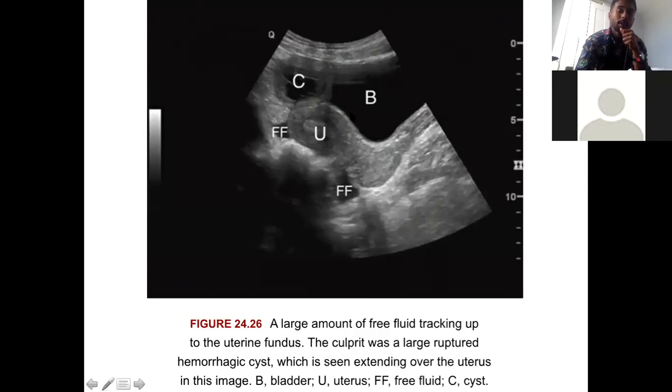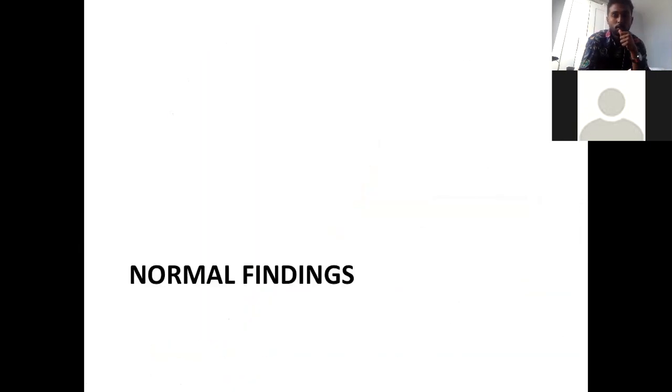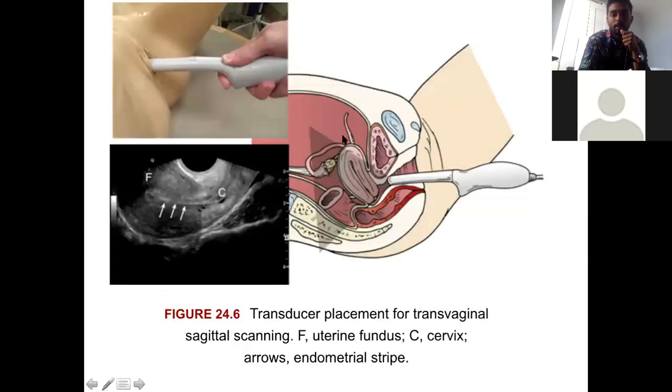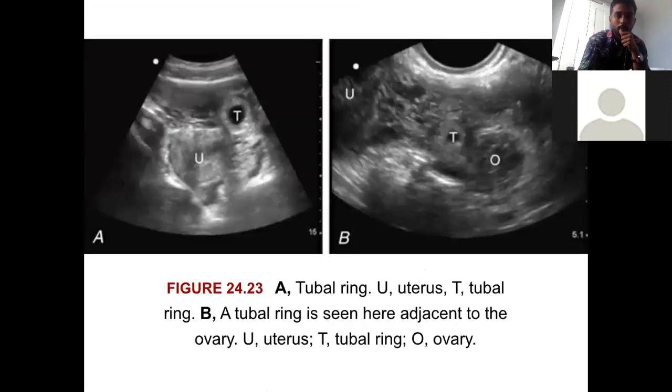The bladder, right? If you're doing a transabdominal ultrasound, you want the bladder full, because it pushes the uterus back. You can see everything in nice profile and it gives some nice contrast. But if you're doing a transvaginal one, you want the bladder emptied and small, because otherwise it's going to block. Let me show something real quick. If the bladder is really big, especially for the sagittal, I'm going over the bladder's head, sending signals out, and a big bladder is going to block a lot of that signal. But with transabdominal, you're going to see a full bladder.